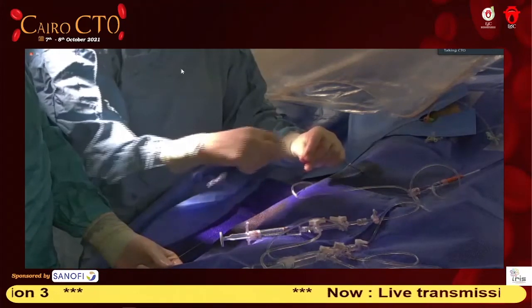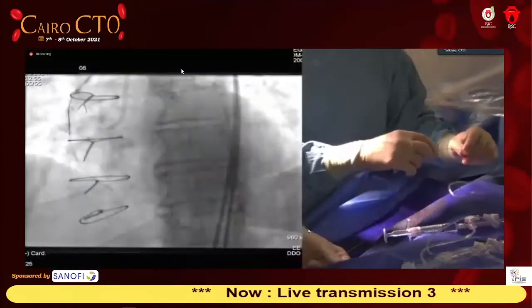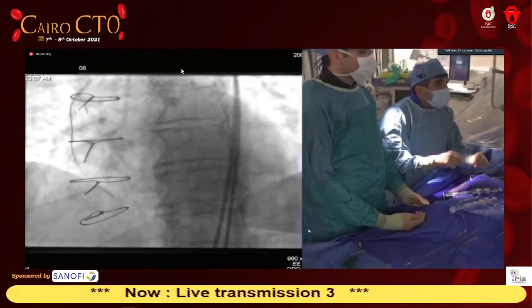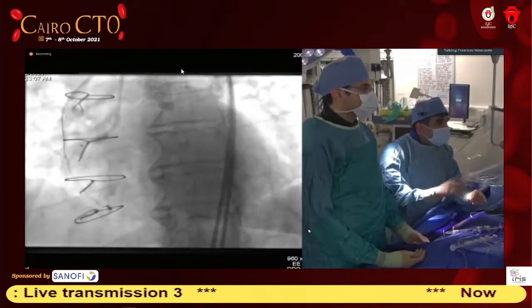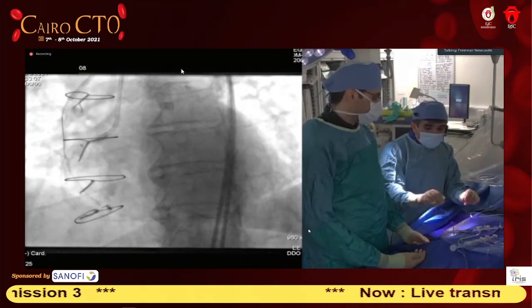Because I said this, you see it coming through the catheter in a second. We want to see the angio. Can you put the angio on, please? Yeah. So you could see the coil coming through, and I'm pushing it. I'm just going to push it a little bit quick here, so when it comes out, see how it's shaped itself? Yeah.